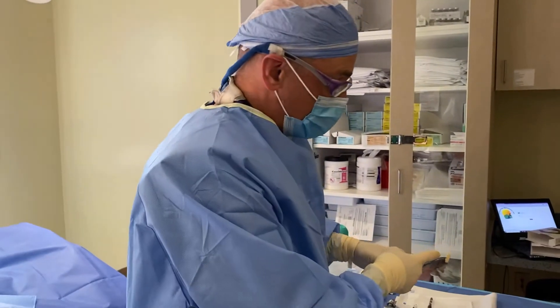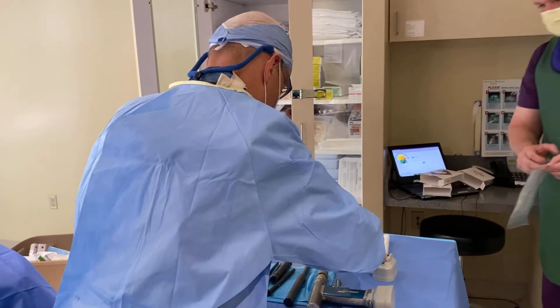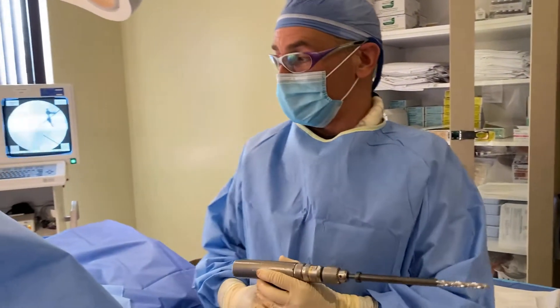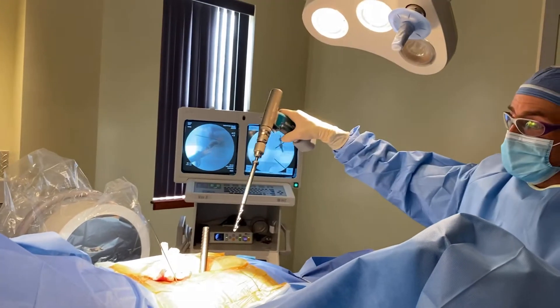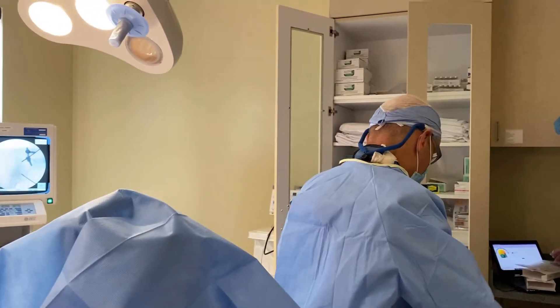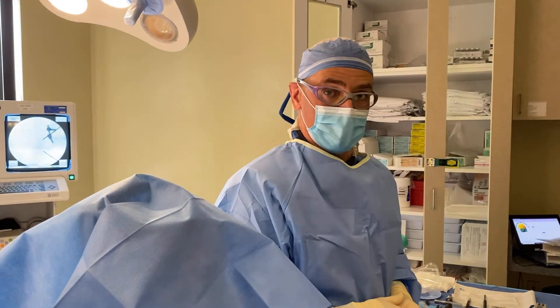This is the bone allograft from the cadaver. We're going to put this in the holder to make it easy to insert. We're basically ready to drill. We'll place this drill down the working cannula, create a cavity in the SI joint, and then make that round cavity a square cavity with the broach device. Once it's square, we'll put the demineralized bone matrix right into that area.